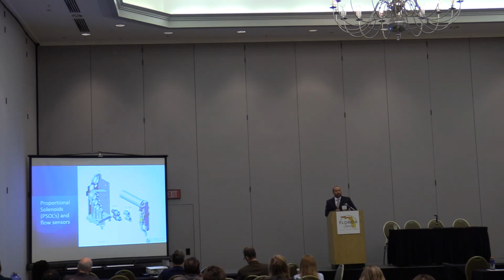And now, mind you, you're not going to be changing these filters yourself. This is something that the biomed or whoever is servicing your ventilators would be doing. But it's something important for you to be mindful of, because you're the ones that are going to be able to advocate for your own ventilator and make sure that these guys are actually doing what they need to be doing.